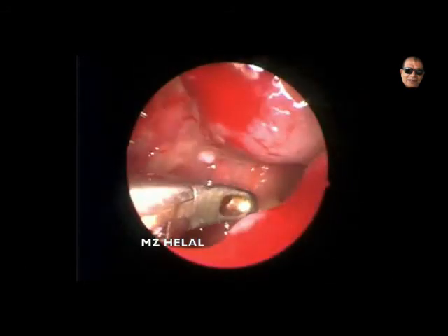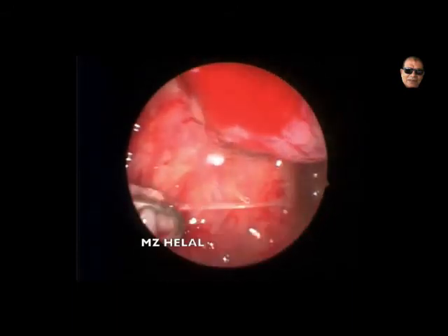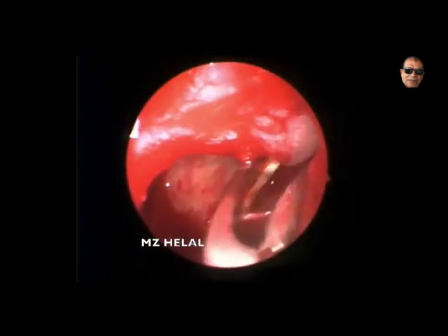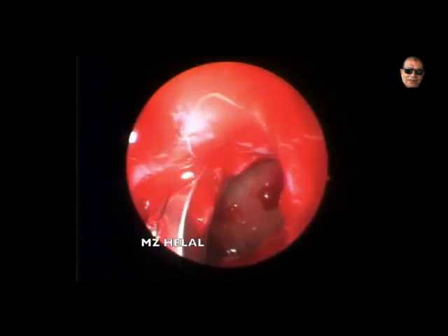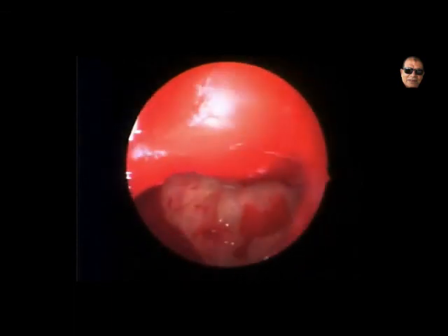This is a retention cyst in the lateral wall of the maxillary sinus, an innocent pathology, but the polypoidal mucosa near the ostium is more important and should be removed, because the most functional area in middle meatal antrostomy is the area where the natural ostium is. One should clean this area cautiously and have this view at the end.